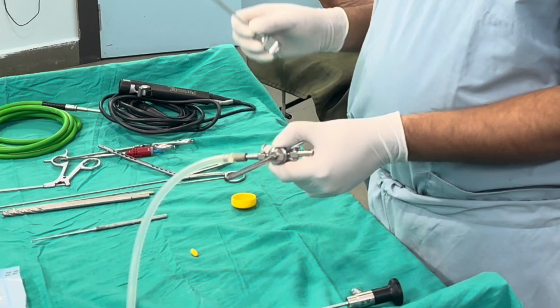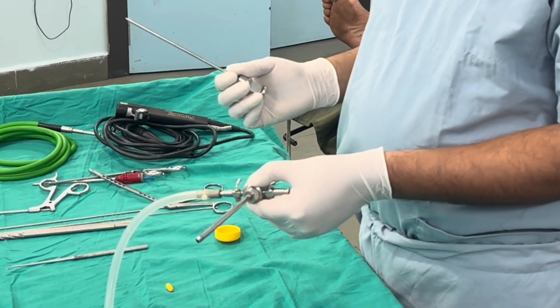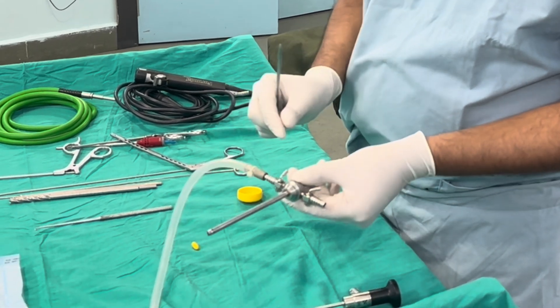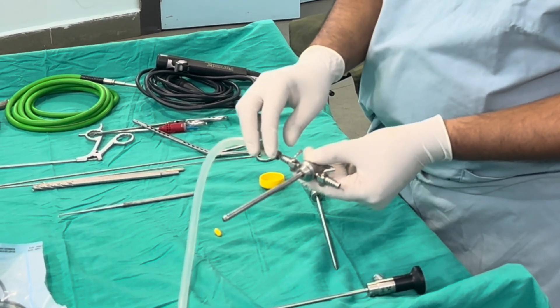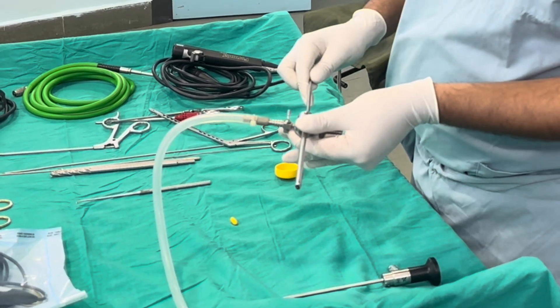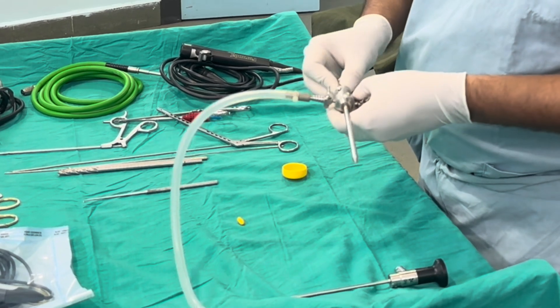The trocar sheath is usually the first instrument put inside the joint, so we should know everything about it. It has two inlet and one outlet ports and a lever lock system. The trocar and sheath go into the joint together.